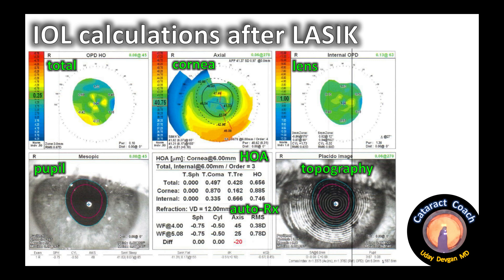The top right box is the lens — that's the internal power of the eye. Looking at that top row, the total power of the eye is the cornea plus the lens, which makes sense. The bottom left corner shows the pupil, with both photopic and mesopic pupil sizes, and also the relative position of the central visual axis to the pupil. The middle box on the bottom row shows the autorefractor, with readings at both a 4mm and a maximum 5mm zone for this eye.